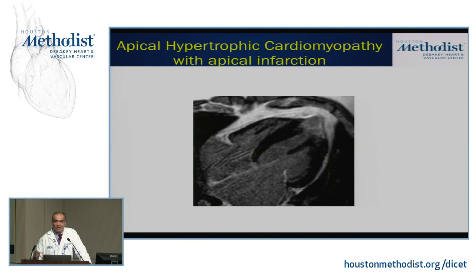And when we do our delayed enhancement imaging, we in fact find that in this patient that apical trapping has led now to an infarct in the apex. So you can oftentimes see in these patients an apical cap infarction.